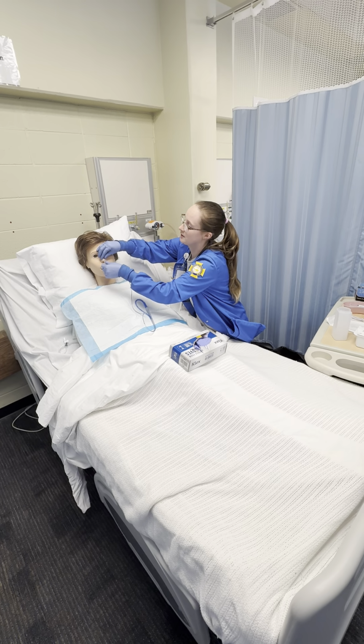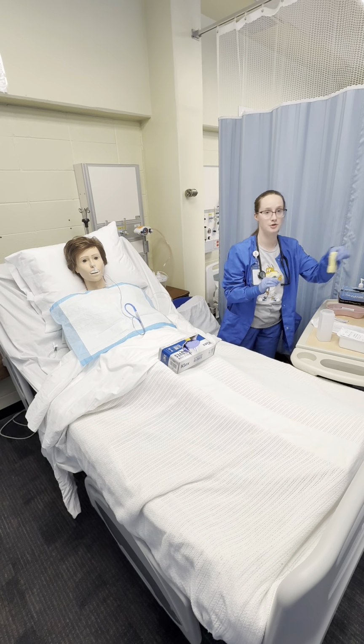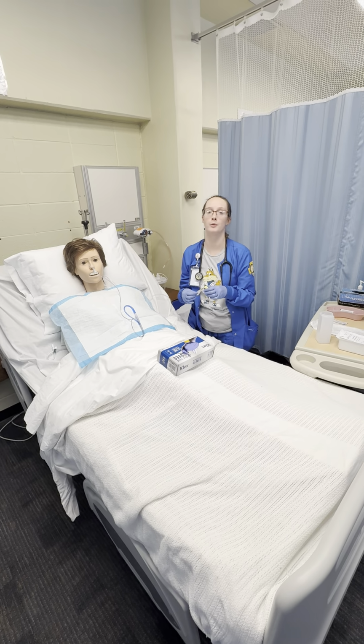So once we get that more securely taped down, I'm going to go ahead and grab my measuring tape, and I'm going to want to measure the exposed tubing outside of the body using centimeters. And then I'm going to start at the tip of the nose and bring it down.